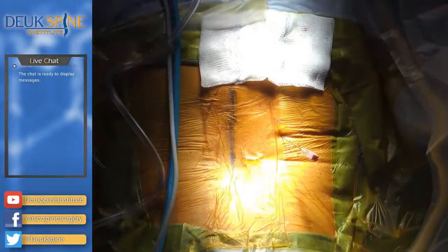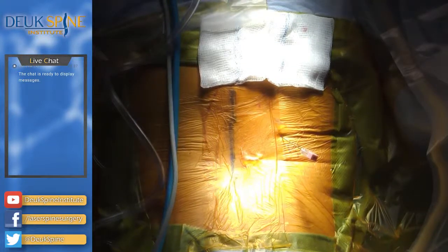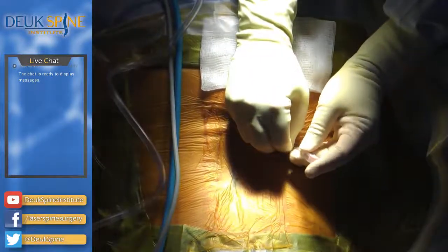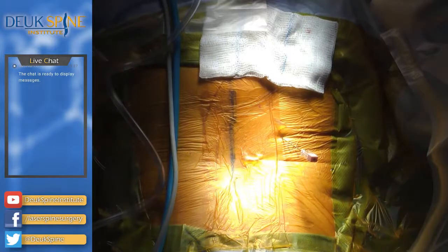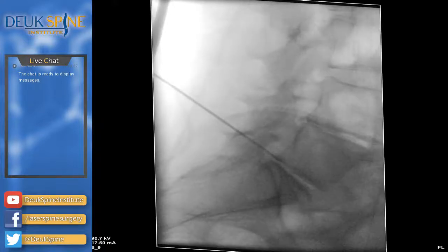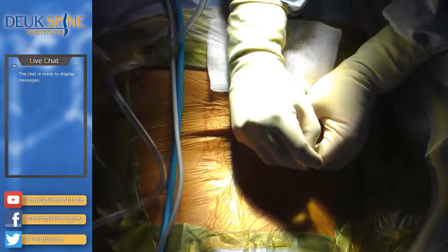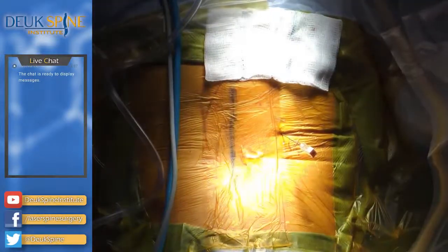What am I saying? Shot. Shot. It means take a picture. That's what I say. That's my thing.